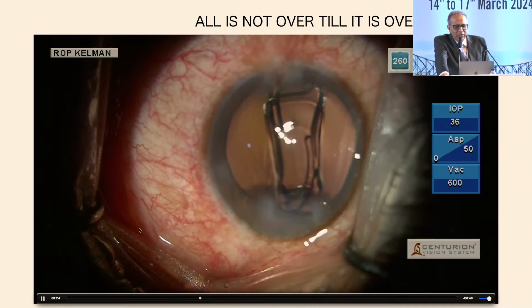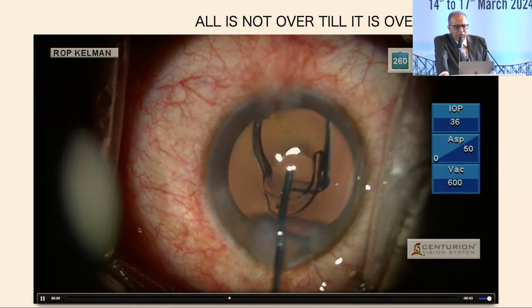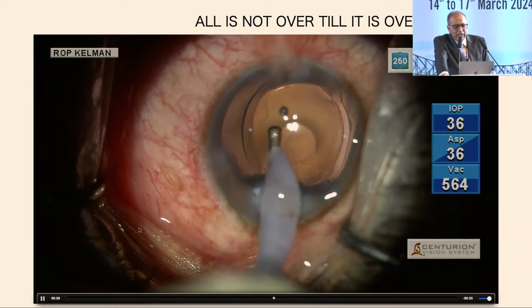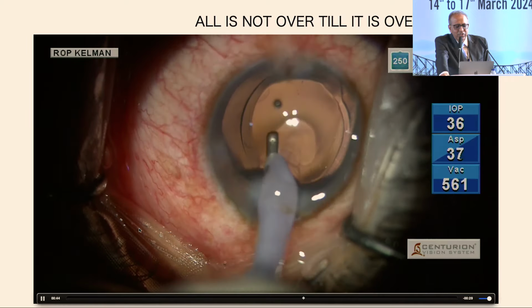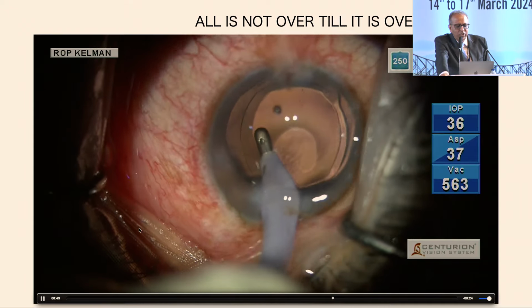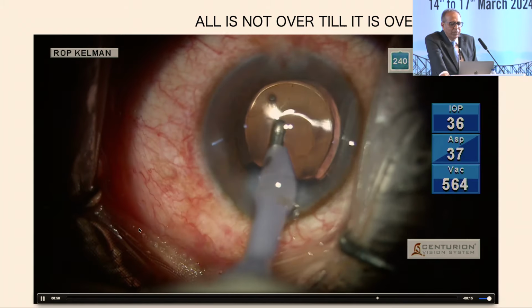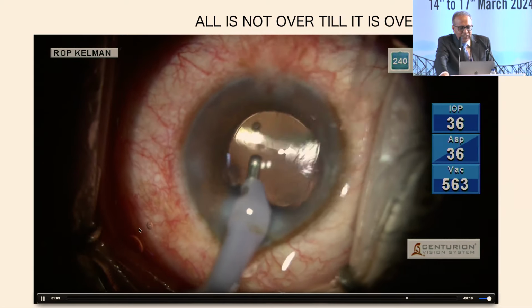And once the IOL is implanted, the next step was to just push it slightly without putting stress on the posterior capsule. And while removing the visco, inadvertently, you just see what I did. I just pushed it slightly, and the moment I push it more than what is required, the posterior capsule will give way. So you will find now that there is an open posterior capsule. I did not touch it because everything was well centered and I just took it out.